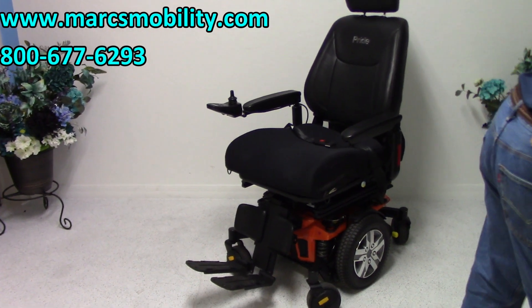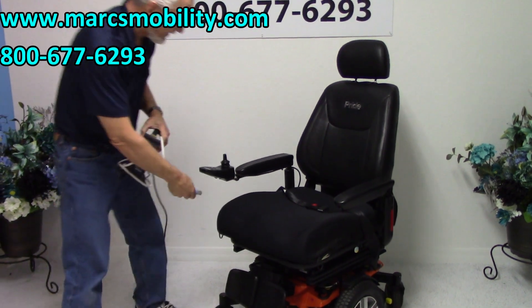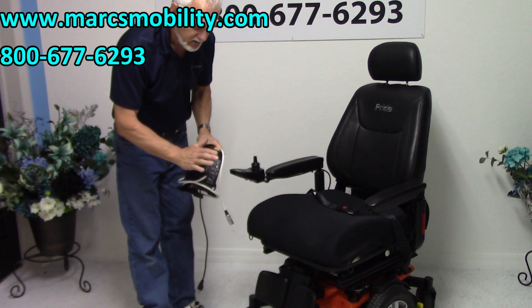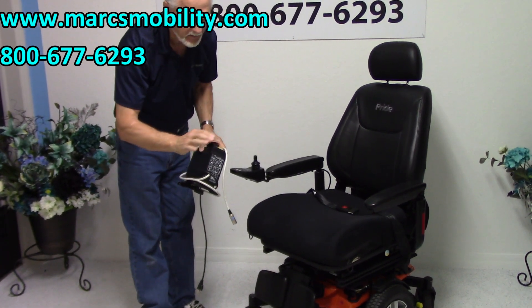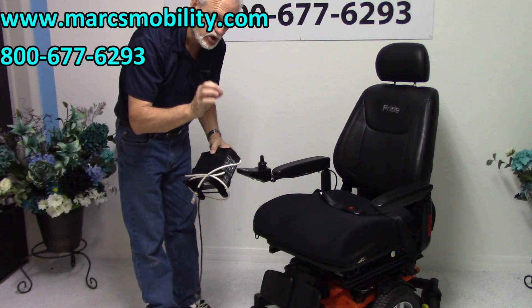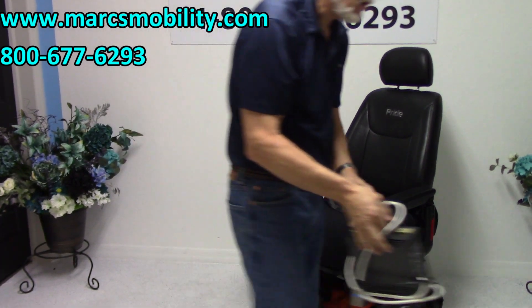When you charge this chair, you'll take your Quantum charger and plug it right here. As soon as the light goes from orange to green, the charger will shut off. The light will still be on, but it will not be charging anymore until it needs a charge. These are smart chargers these days.